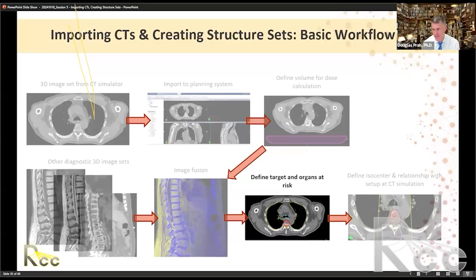Additionally, for the VMAT ones for DIBH, I would find that pretty challenging for a patient, because VMAT deliveries tend to be longer and you would have to interrupt the beam. So we find that the treatment time is prohibitive. It's prohibitively long for patients to do a DIBH VMAT. So for our breast patients, we tend to do a 3D because we can treat them more quickly.